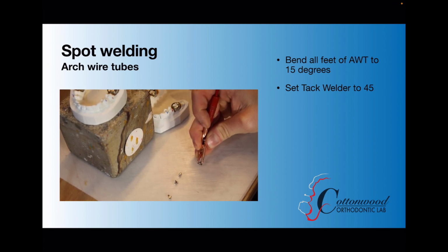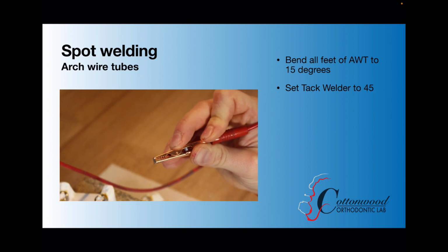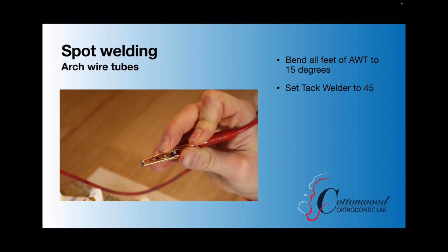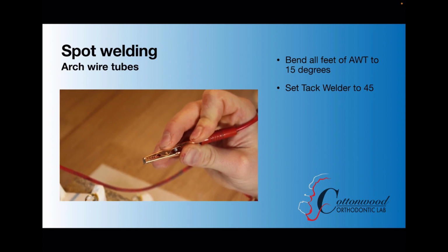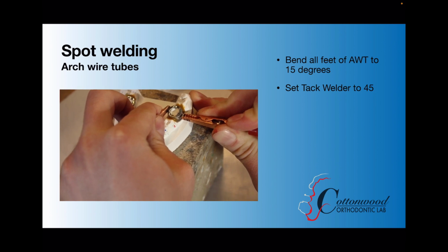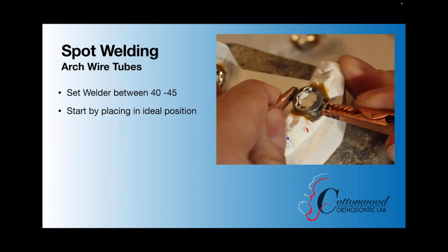We utilize a Tack 2 welder along with these alligator clips to help be a little more tactile. We set our Tack 2 welder to about 40 to 45. If you don't have a Tack 2 and you're using a Dentarum welder, you're going to set that on the highest setting, number 5, that you can. And occasionally you are going to blow some holes through these bands. You want to make sure those alligator clips are clean, and you want to make sure the bands or crowns are free of wax and debris, so that you don't blow holes through your crowns or bands. So excellent. So there you go.